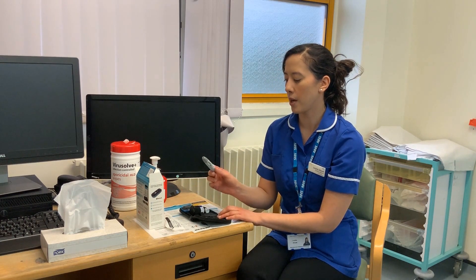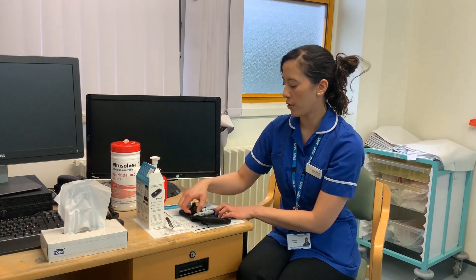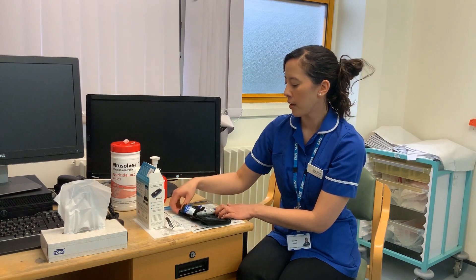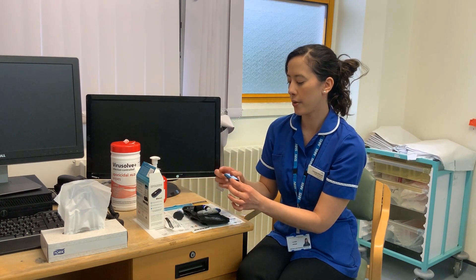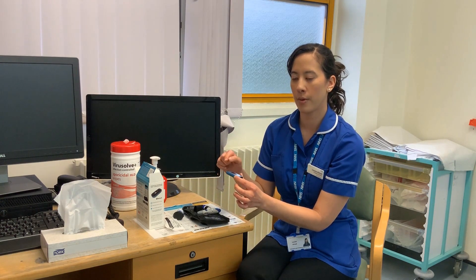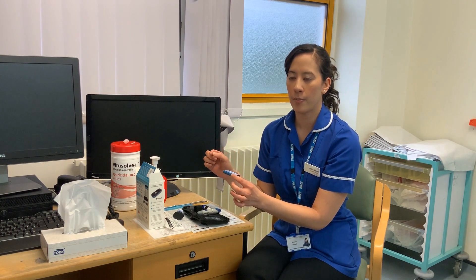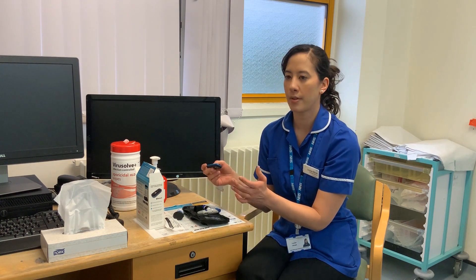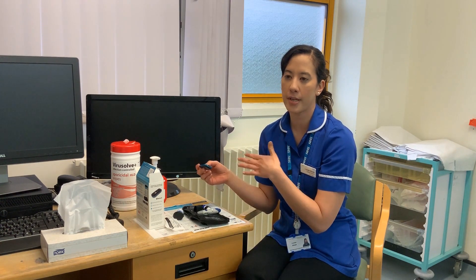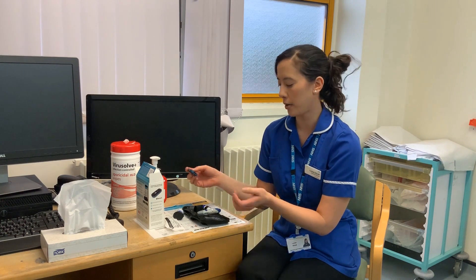In your kit, you've got your lancet device, which you would use to prick your finger. You've got your testing strips, and then your meter, which works via Bluetooth and syncs to your phone. On your phone, you've downloaded an app called the GDM Health App, which allows us in the diabetes team to help you monitor your blood glucose levels.